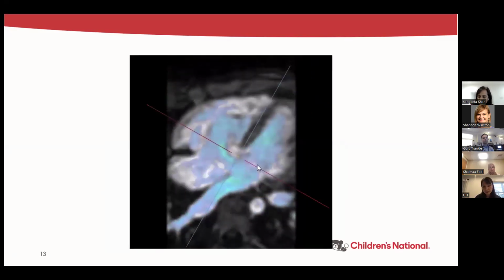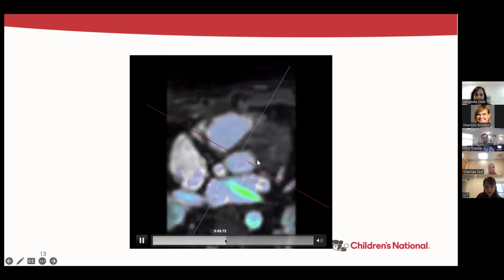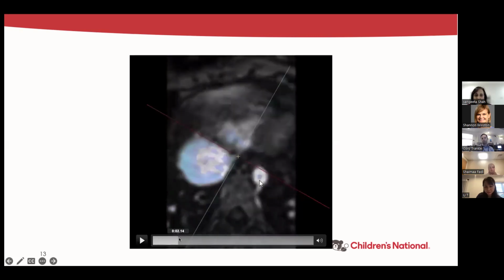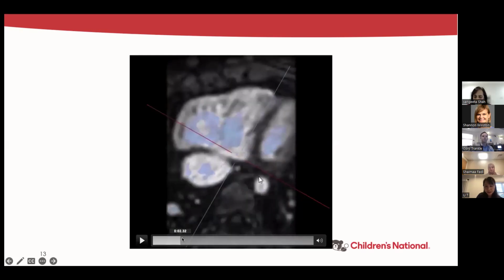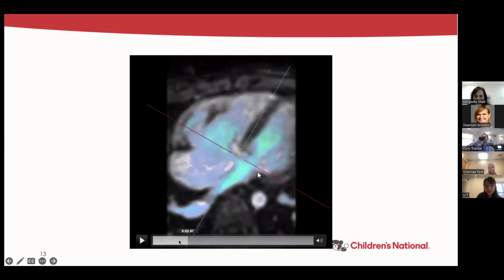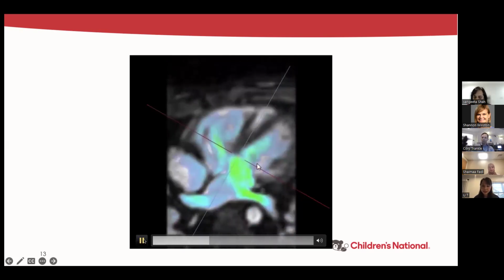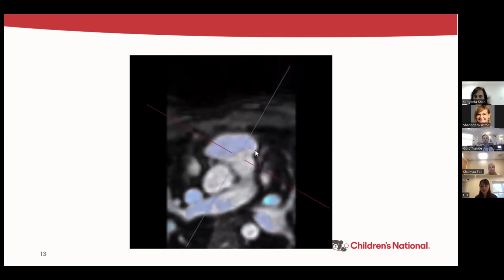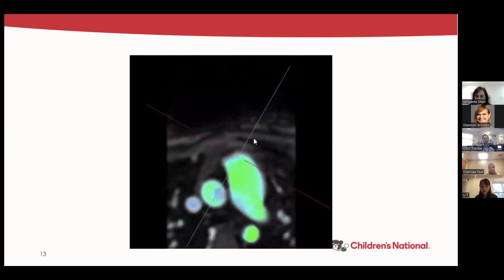You can see at the beginning of the sweep how dilated the IVC is, and how dilated the right ventricle is, and see that there's no significant regurgitation through either AV valve, and obviously no stenosis and no coarctation.